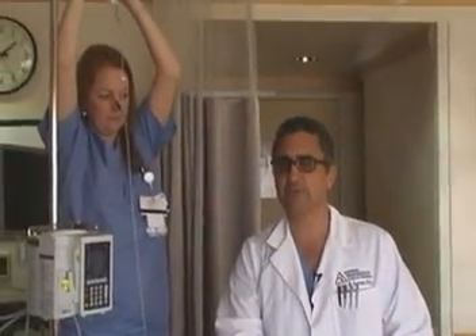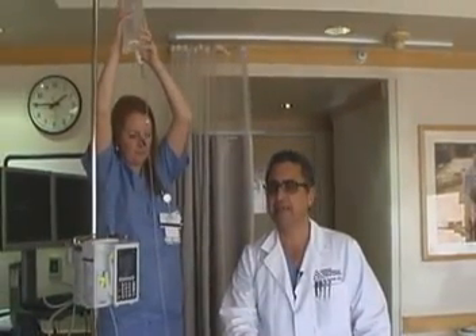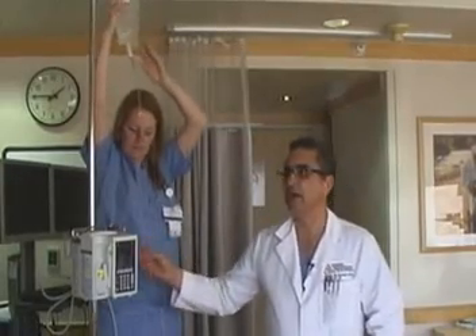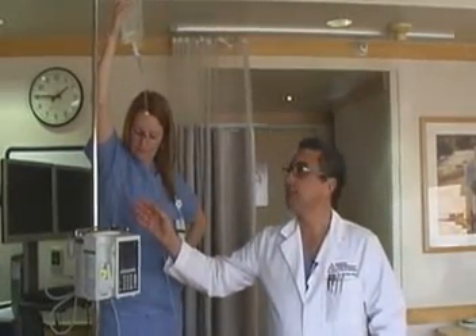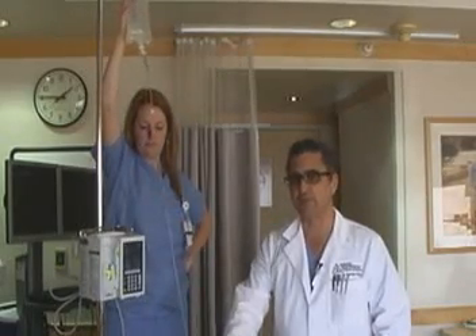The principles of this technique require that two liters of warm saline be infused under hydrostatic pressure into the vagina. To obtain this amount of hydrostatic pressure, one should have an IV pole that is extended to at least six feet above the level of the uterus.